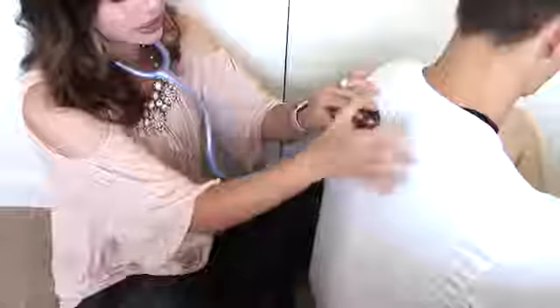So I know we're kind of at a weird angle, so bear with us, but this is obviously Jesse's back, and when I was in nursing school, I was told there's like 10 or 12 spots to listen to. Honestly, I say that there's 6. The first spots you're going to listen to are the top of their lungs, which is kind of right down their back here, and you obviously want to listen on both sides.